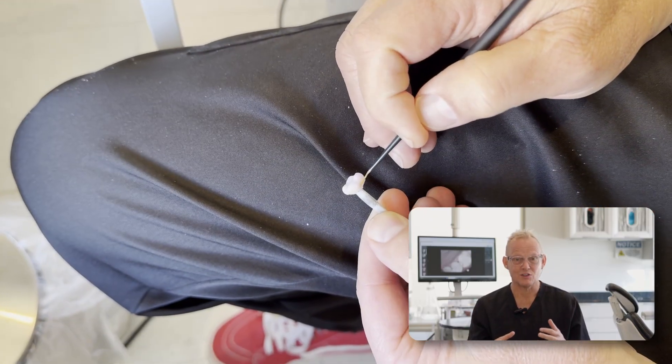I do this all the time to make sure the teeth are both functional and look beautiful. I want to make sure the patient has the highest quality aesthetics as well as the best material, while being conservative in my preparations. I love using the CEREC machine — it's a wonderful way to get a same-day crown.